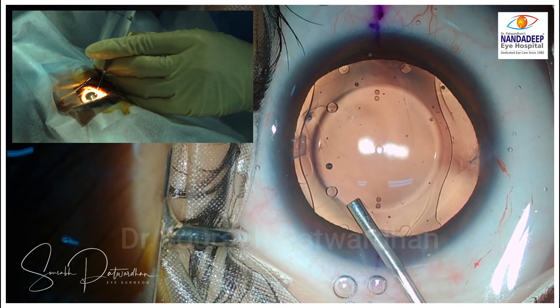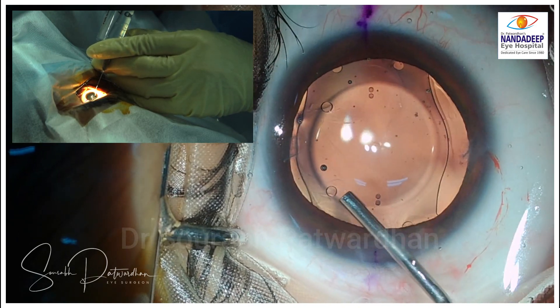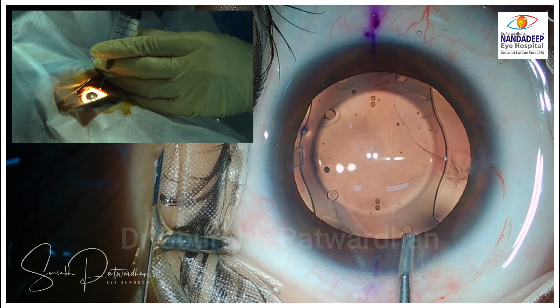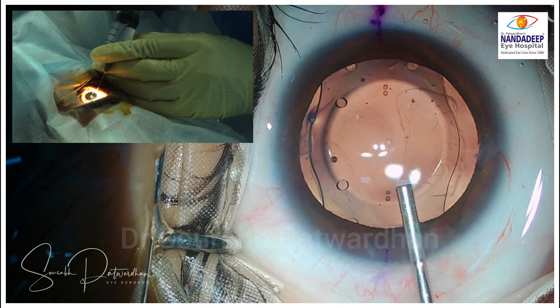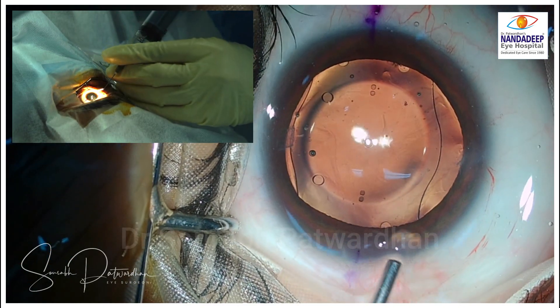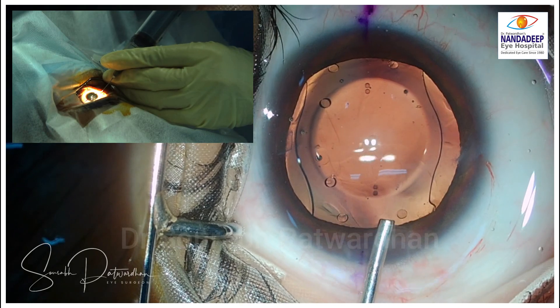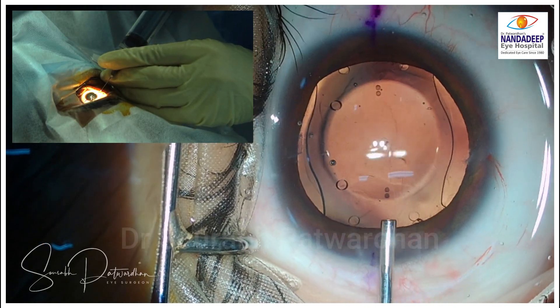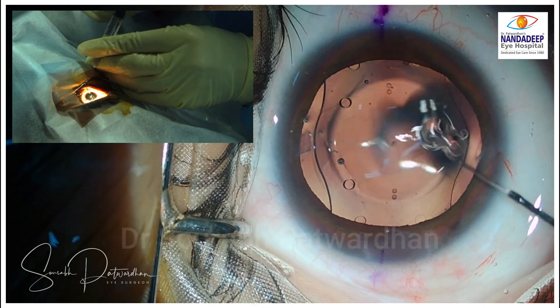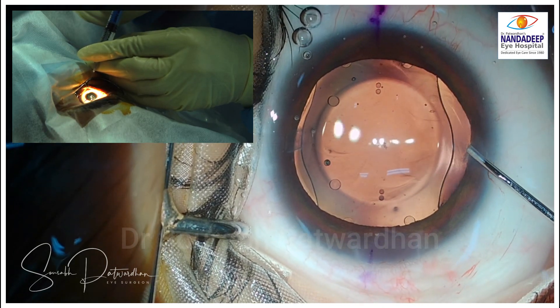The logic is that when I use this flushing of fluid in the anterior chamber, the anterior chamber remains quite steady with very few fluctuations compared to using bimanual IA or coaxial IA. These are high myopic eyes and I don't want fluctuations during surgery. When I flush BSS all around in the anterior chamber, the 2% HPMC starts getting washed off. I use a 10cc syringe, and also a 2cc syringe to flush BSS underneath the IPCL, so the fluid trapped between the anterior lens capsule and the IPCL also gets washed off.